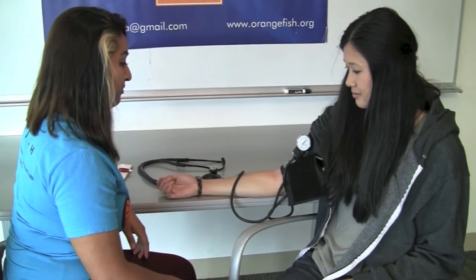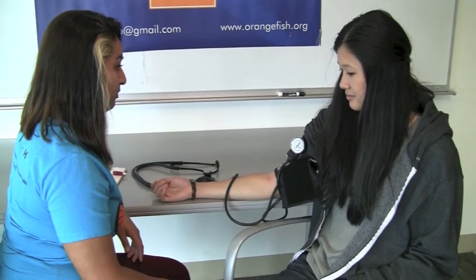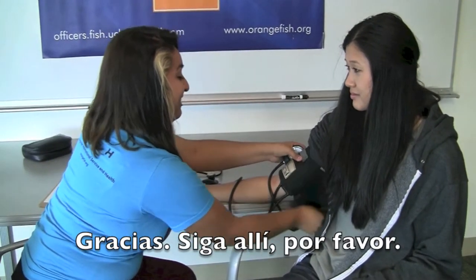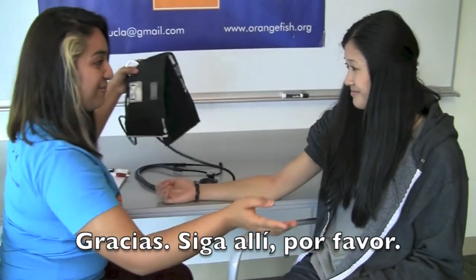When finished with the procedure, thank the patient and direct them to the blood glucose station. In Spanish, say: "Gracias. Siga allí, por favor."